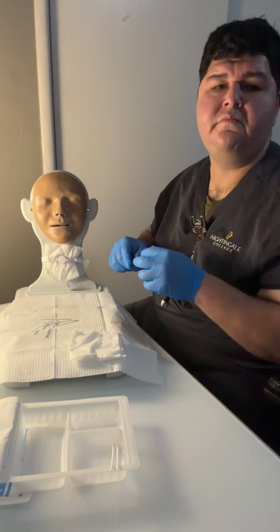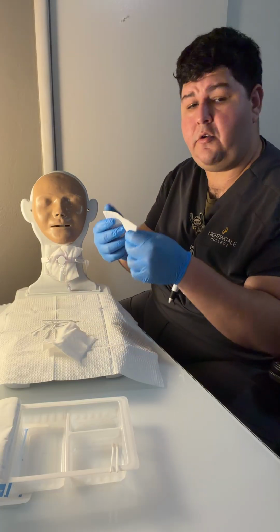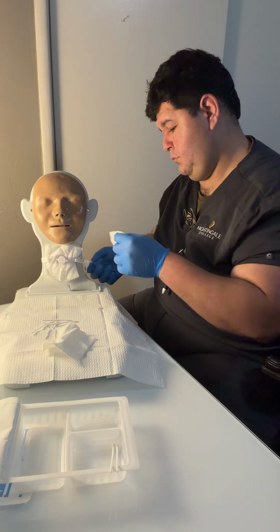Okay, and then I would want to take a 4x4 and then place this under the tie portion where the knot is, so that it doesn't create a tear on the skin.